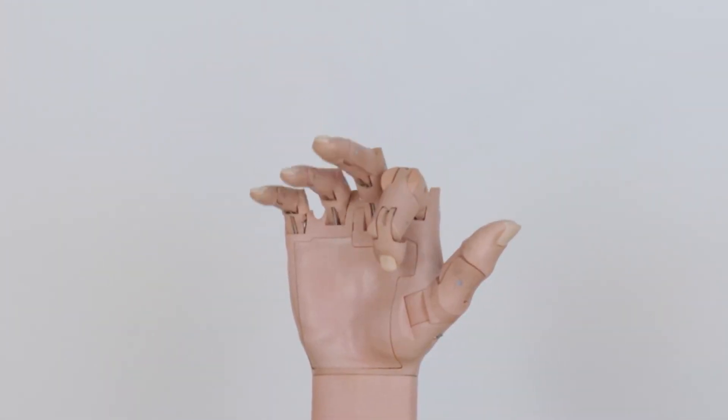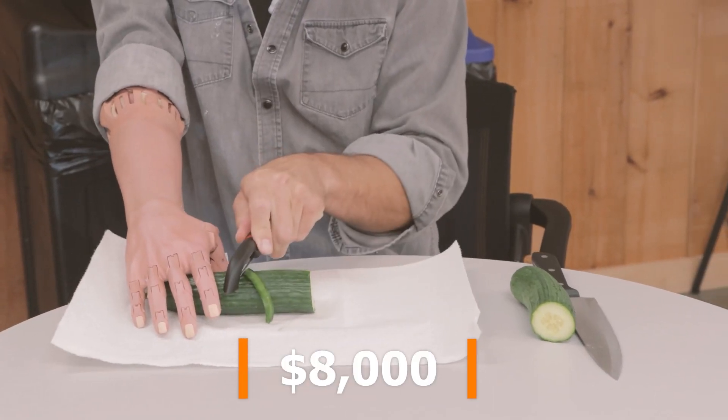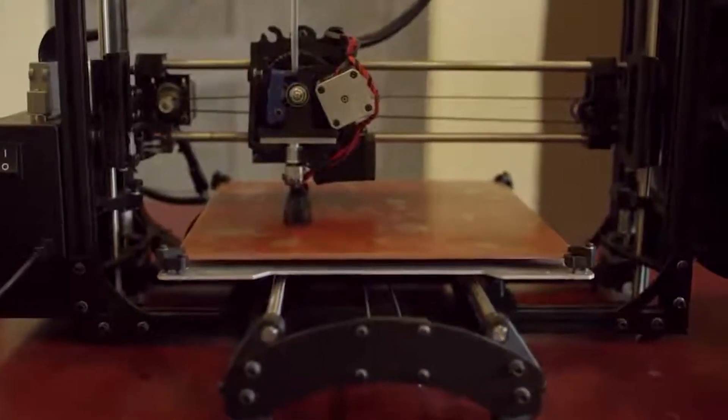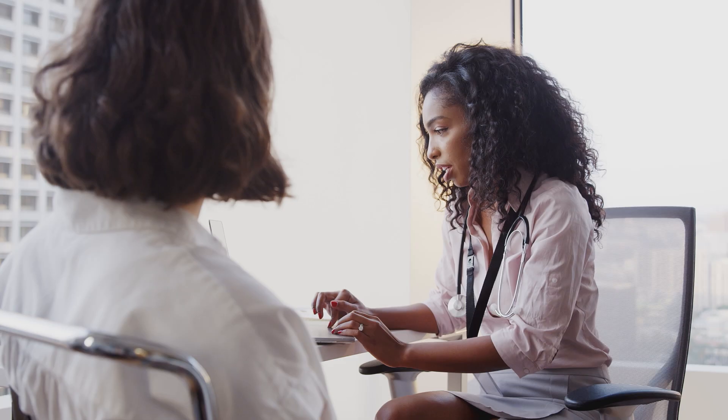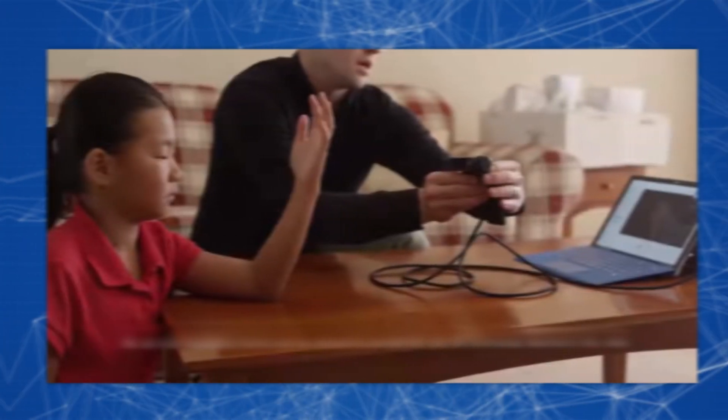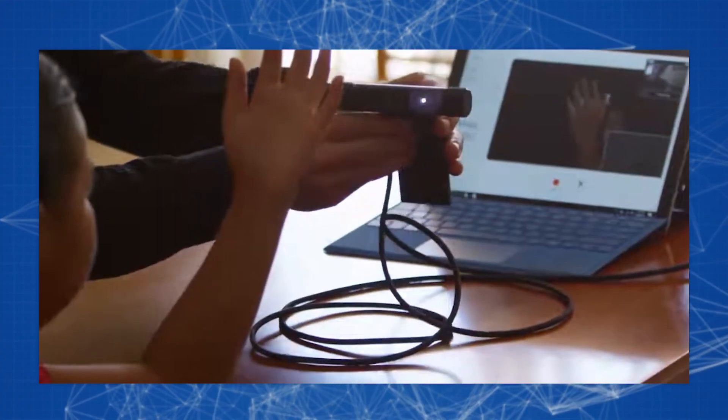The founder of Unlimited Tomorrow managed to reduce the cost of a bionic arm by almost 10 times, up to $8,000, by using 3D scanning of the stump and 3D printing of personalized prostheses. If earlier a person with an amputated limb had to personally and repeatedly go to the prosthetist's office for fittings and consultations, then LaChapelle suggested entrusting the measurements and fitting of prostheses to the patients themselves.